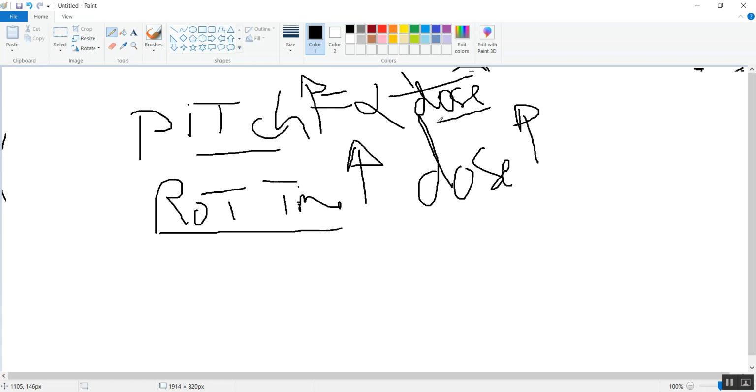All these parameters you can change easily in your machines, but you have to optimize them to get diagnostic image quality. Because sometimes if we increase the pitch factor beyond a certain level, it will cause problems, or losing data in some images, especially in fine details regions. If pitch factor is greater than 1, it will cause problems in fine details.